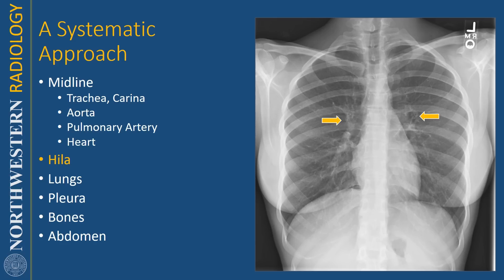Then I look at the hila. The hila are paired structures — really just the root of the organ. You can talk about the renal hila, the splenic hilum. It's basically that part of the organ where the vessels enter and exit, and in the case of the lungs, it's also where the bronchi branch out. On the frontal radiograph, the left hilum is usually slightly higher than the right hilum, or they can be at the same horizontal level. Usually the right hilum is not higher than the left, and if that is the case, you're probably looking at something abnormal.